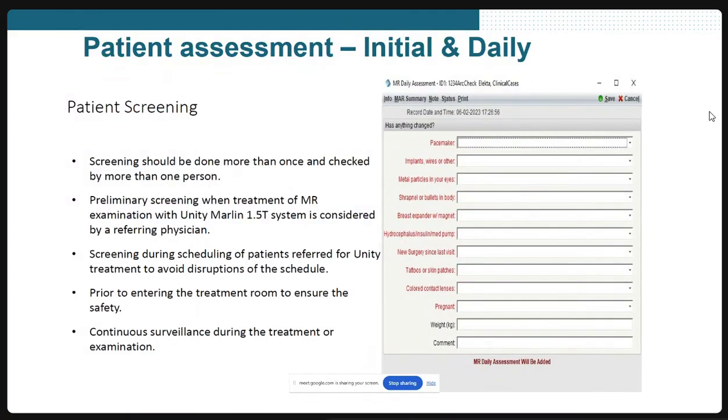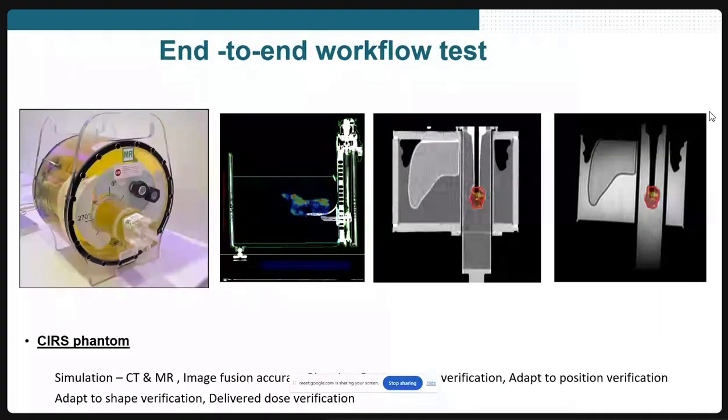So this is another aspect: we have radiation safety, MR safety, helium safety, and then patient safety is also very important. It creates a lot of safety requirements, but it has to, because at the end of the day, you want to do a proper job.